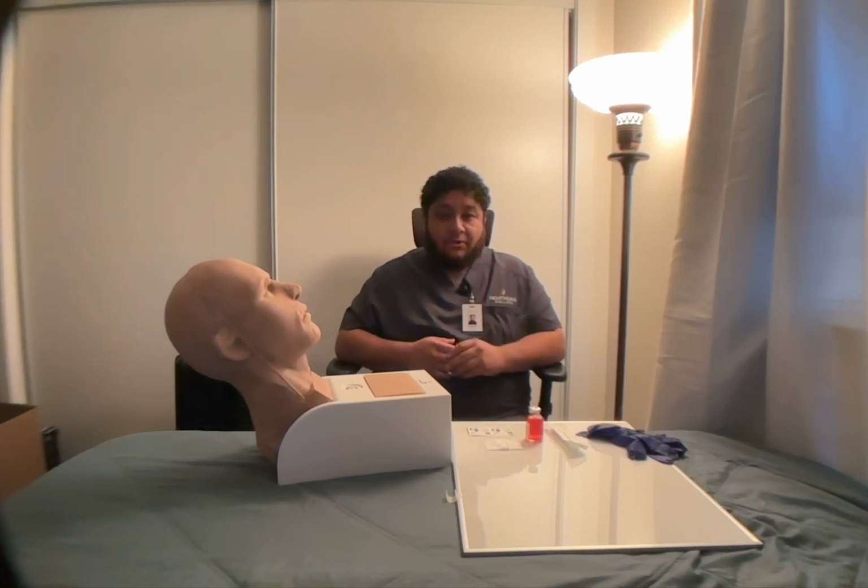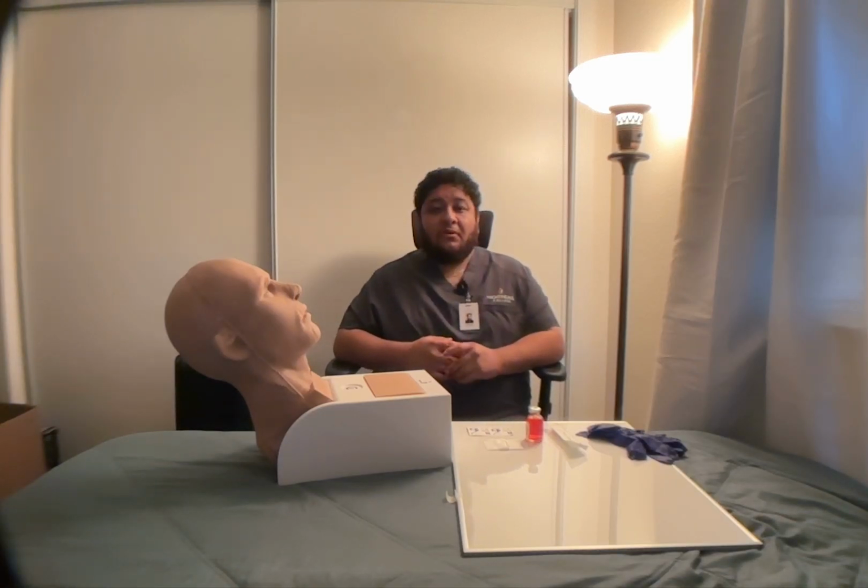Okay. So, I will begin this video by verifying the healthcare provider's orders, and I'm going to go ahead and verify the 6 rights of medication administration, starting off with right patient, right drug, right dose, right route, right time, and lastly, right documentation.